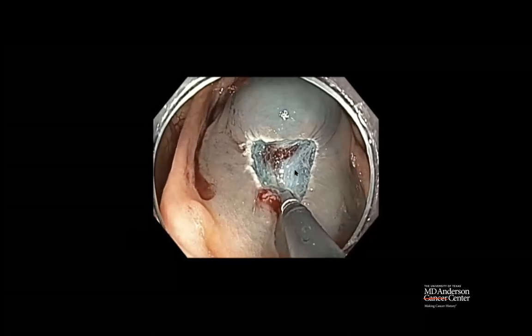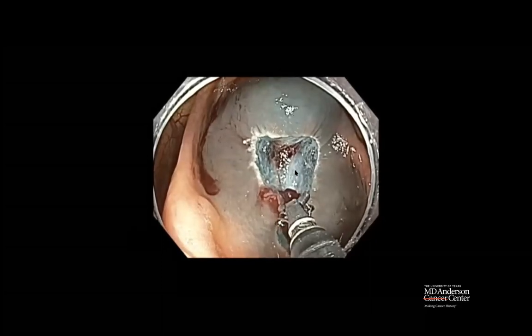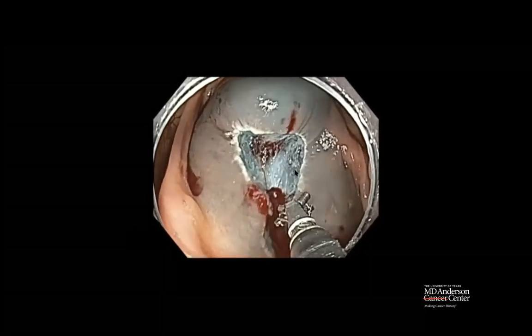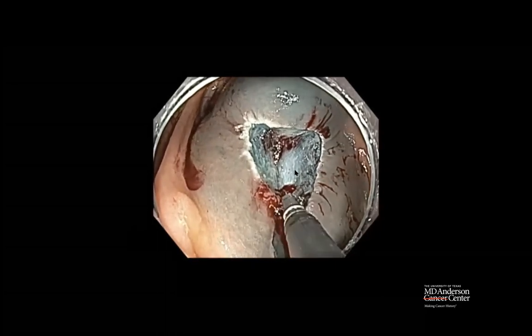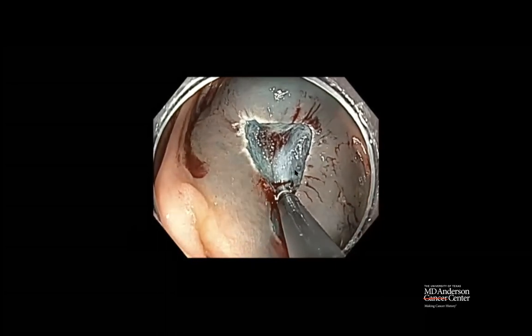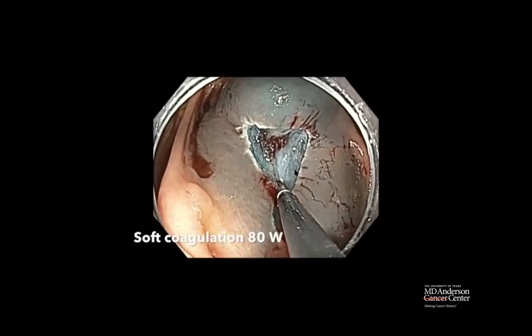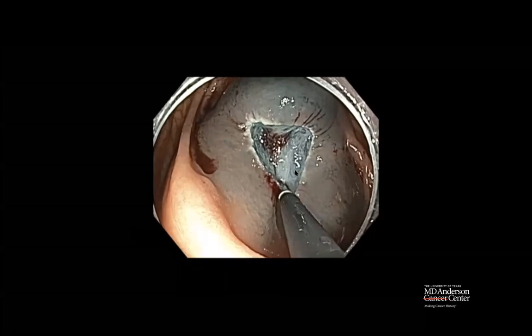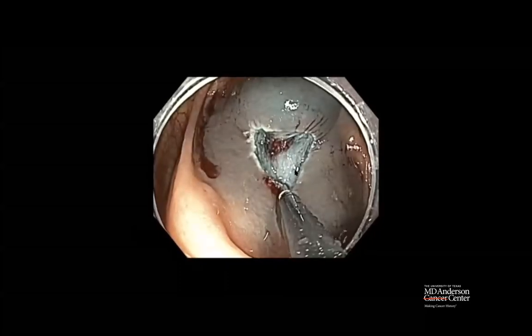And we tapped on the blue pedal, but we did not achieve hemostasis. So go back, increase the wattage to 80 watts, and apply some more current.